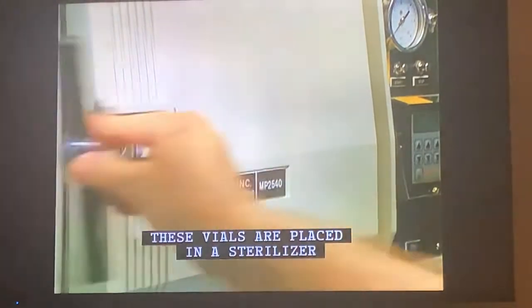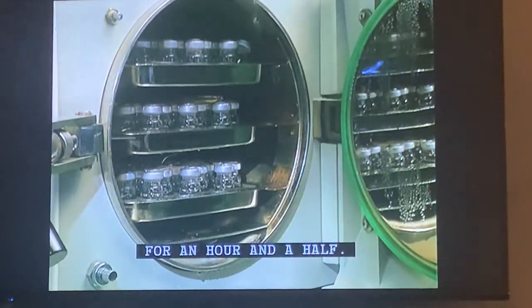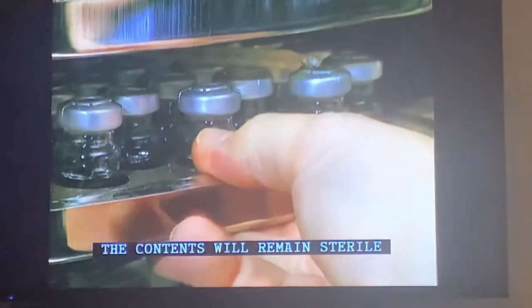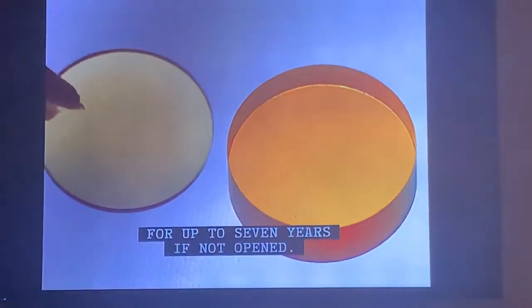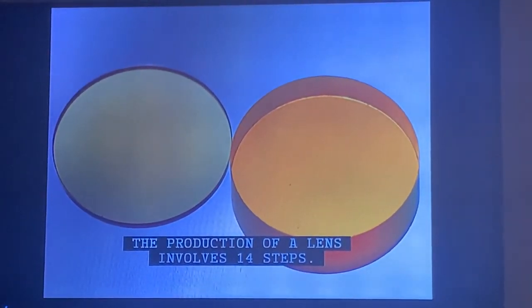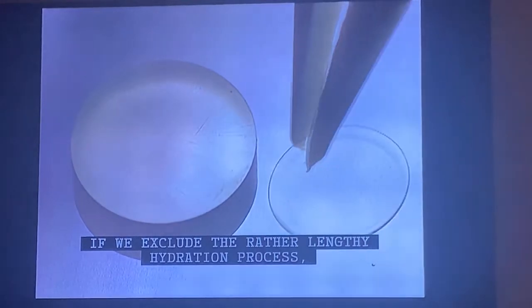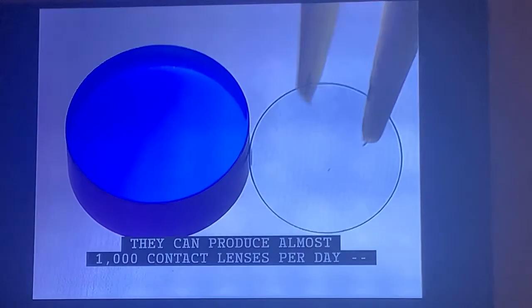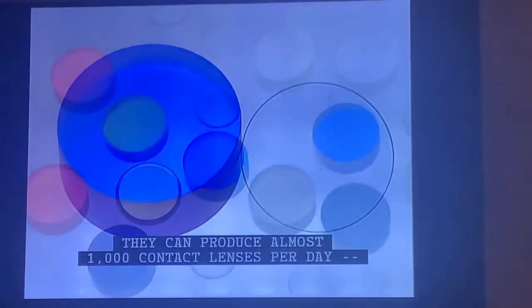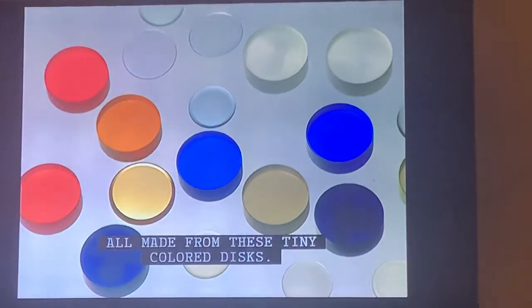These vials are placed in a sterilizer at temperatures of 250 degrees Fahrenheit for an hour and a half. The contents will remain sterile for up to seven years if not opened. The production of a lens involves 14 steps; if we exclude the rather lengthy hydration process, actual lens production requires only 15 minutes. They can produce almost 1,000 contact lenses per day, all made from these tiny colored discs.